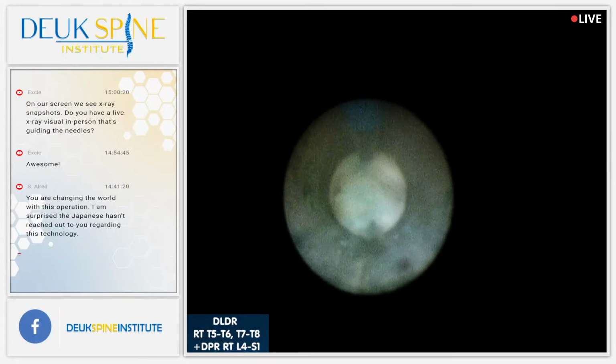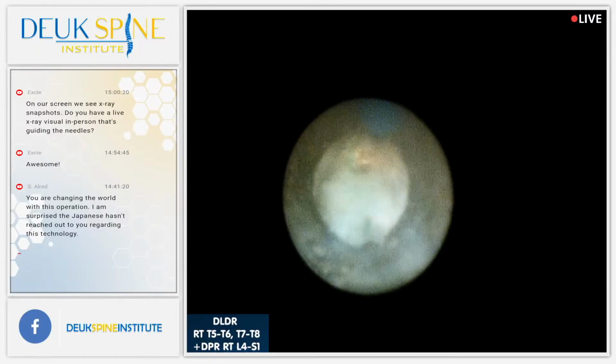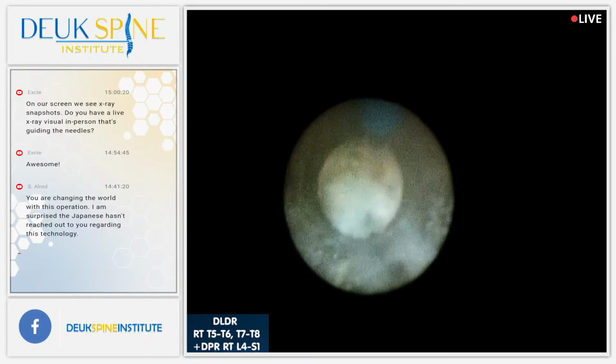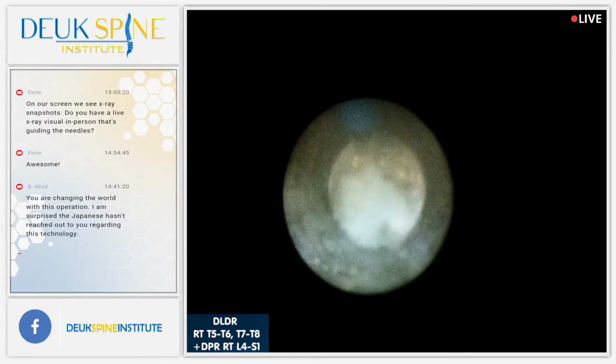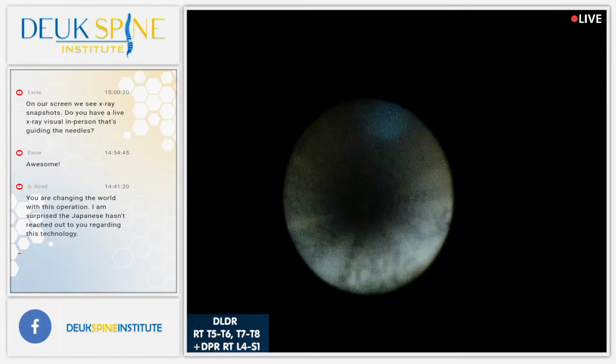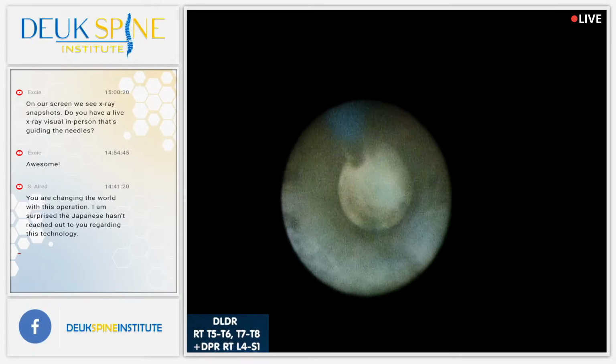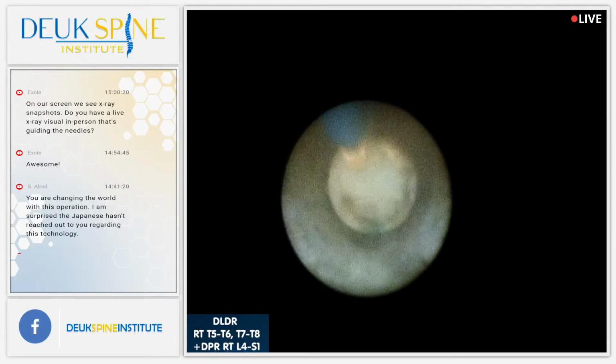See the tear right there? The laser is hovering right above it. So the white stuff is the annulus, and it's torn right there. And so I've got to go in there and clean that tear so that the annulus can now heal properly and painlessly. That's what's going to happen. When you do this to the disc that's painful, when you clean the tear and you get rid of that blue stuff stuck in there, the nucleus, you basically eliminate the source of inflammation surgically, and that allows the disc to heal naturally.